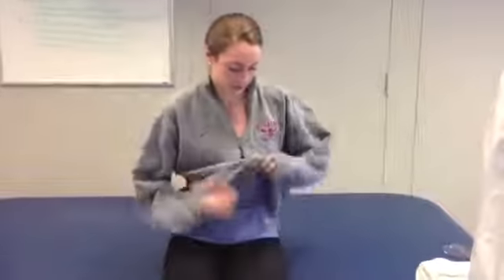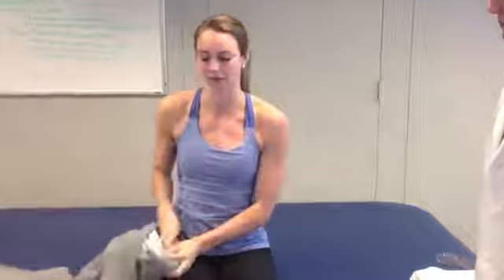And now we're going to show step-by-step directions on goniometric measurements for external rotation. Step 1, expose the landmark. Step 2, patient lies prone.